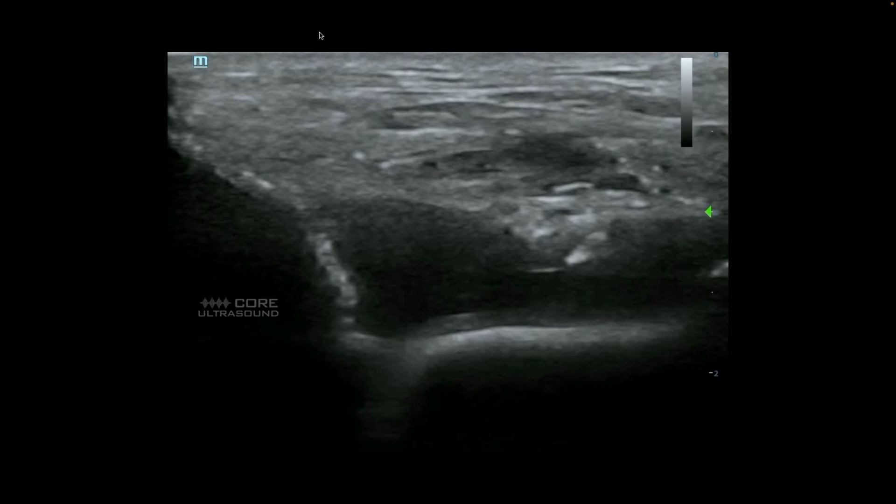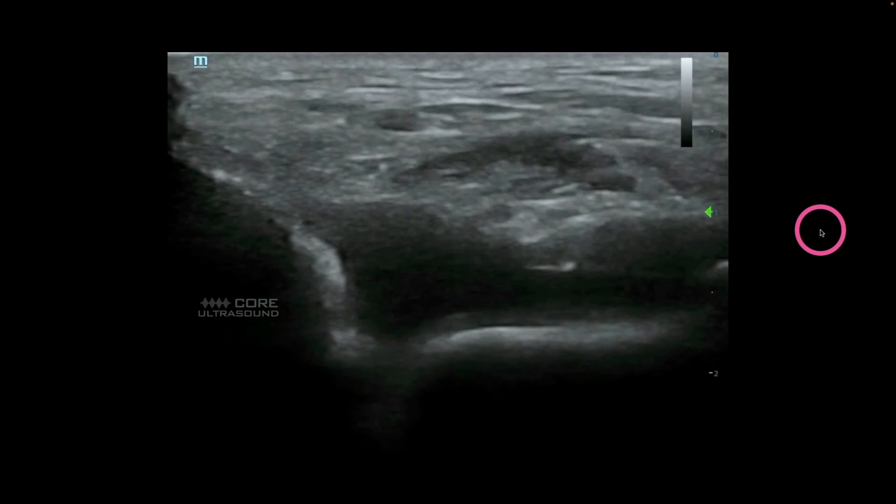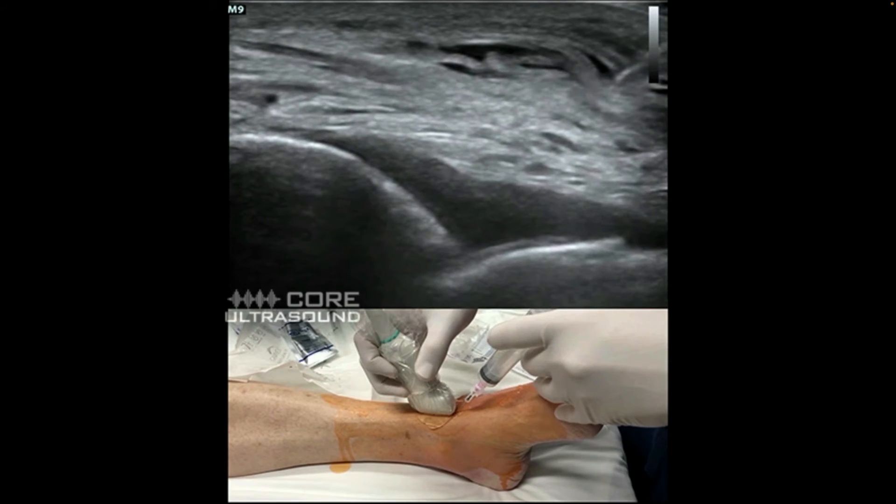Here's an example of performing an aspiration on an ankle effusion with the needle in-plane. We have the transducer in the same location — this is the tibia, this is the talus — and we're coming from caudal to cephalad. You can see pretty good needle visualization, at least better than with the way out-of-plane technique. The issue with in-plane for such a small joint is the amount of space — it's a small area, and you'll have to traverse a further distance from skin to that area, and you often don't have the opportunity to redirect well.